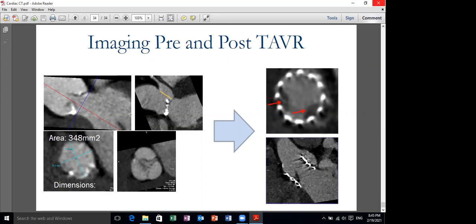السباتيال ريزوليوشن يقدر يوري الكواليتي اوف ذا ايمج. والفيلوسفي بيهايند ال 320 ماشين مش علشان سباتيال ريزوليوشن، هو معمول علشان تو ديكريز الراديشن دوز. بما انه بيستخدم سنجل شوت يفريز الهارت ان سنجل كاردياك سايكل فهيقلل الدوز اوف ذا راديشن. فده الفروقات ما بين السباتيال والتمبرال.